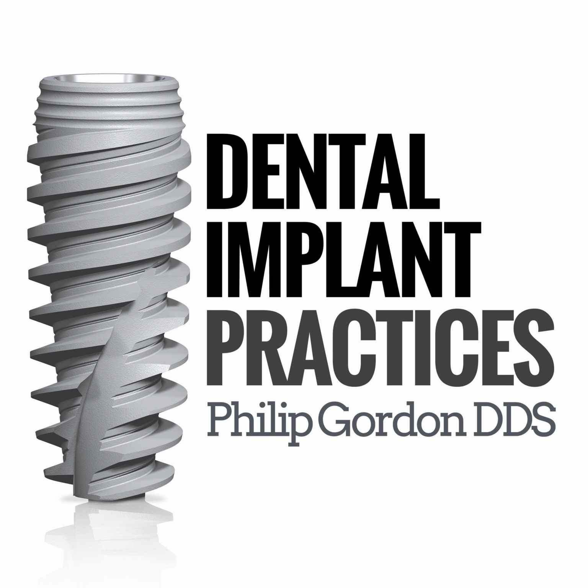And we walk through it with you, because again, it's just another tool in your toolbox that'll help you achieve this case the way we planned it. Yeah, that's excellent. I don't know anybody else who's doing anything like that. You're virtually doing the procedure, and then literally doing it on models, and by the time you're doing it on the patient's mouth, you've done it once in your head, done it once physically, and that's almost your third time through. So you're already adept at using those parts, putting that puzzle together, and you know in your mind's eye where it's going ahead of time.